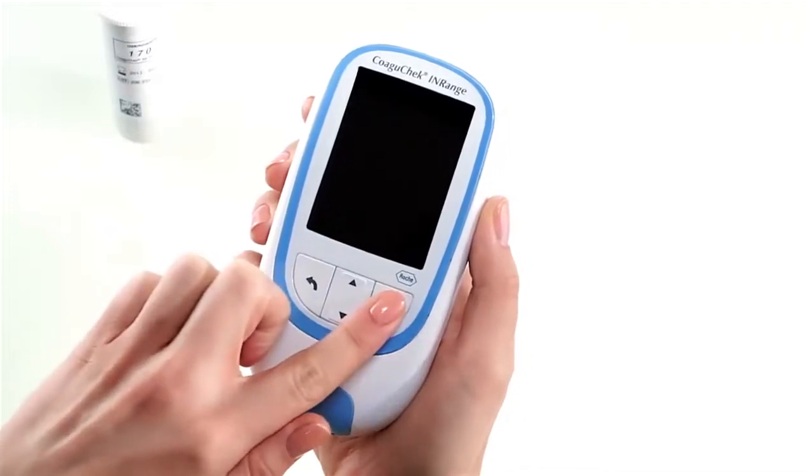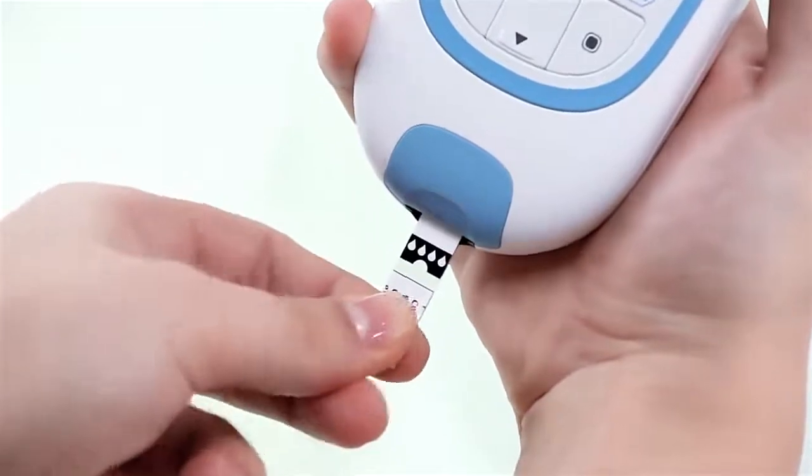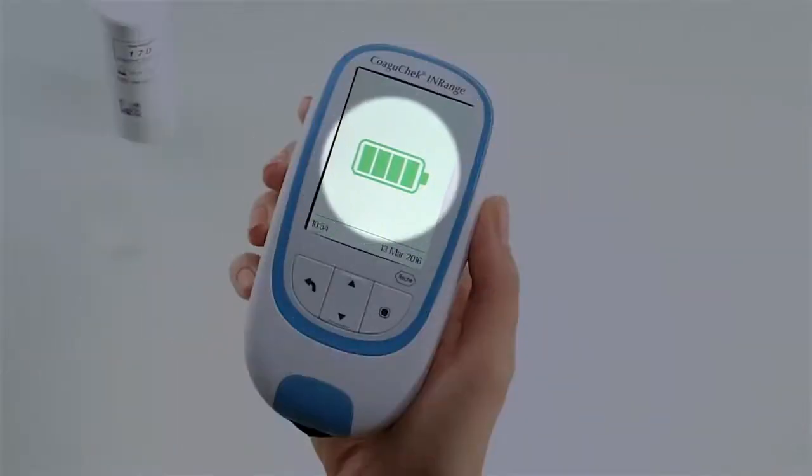Switch the meter on by pressing the enter button. Or you can insert a test strip into the meter — this will turn the COAGUCHECK INRANGE meter on and will put the meter, after start-up, into test mode directly. If the meter displays a battery low message, you can still perform up to three tests. Remember to replace the batteries as soon as possible.